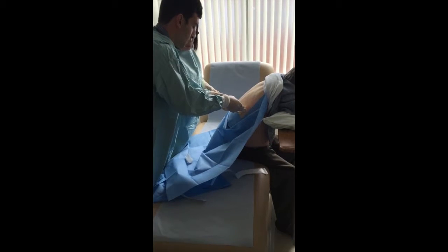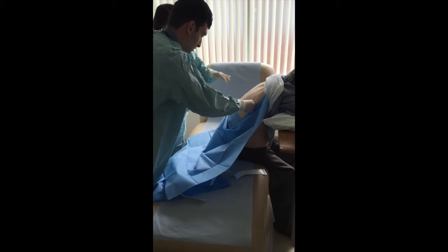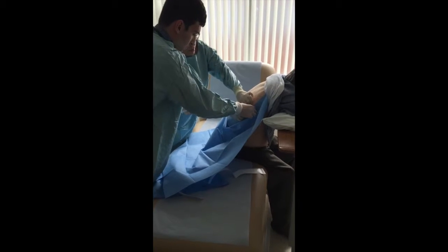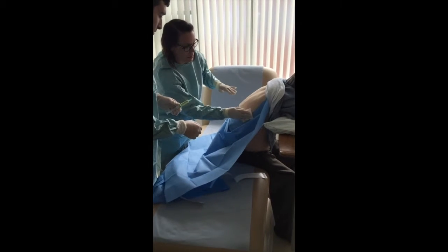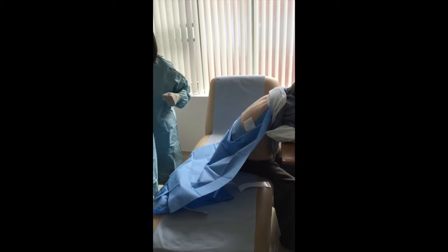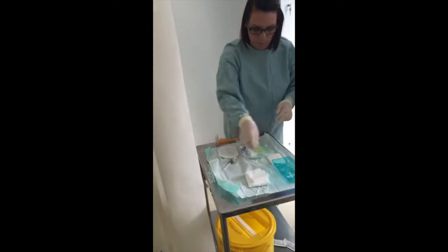So pick up a piece of gauze. Just put that straight over. Okay. And then you can let that local anaesthetic take effect while we get the kit set up. And I'll just show you setting up the kit here, with all the sharps in here.